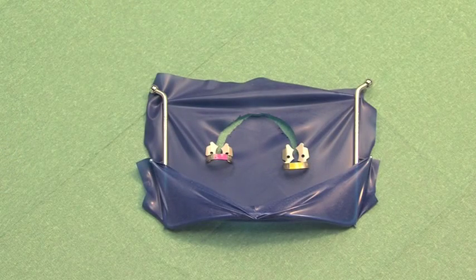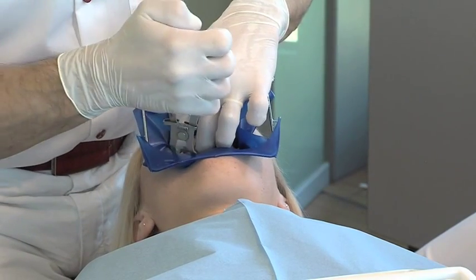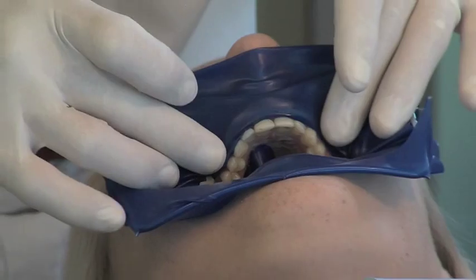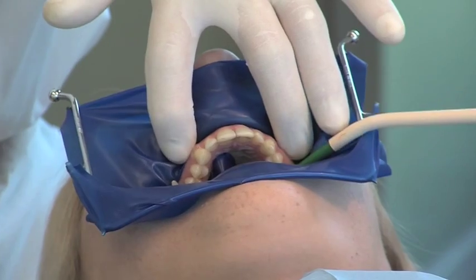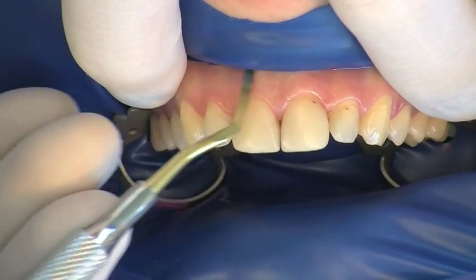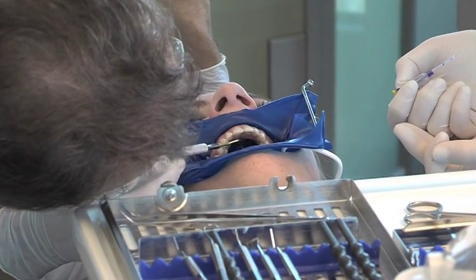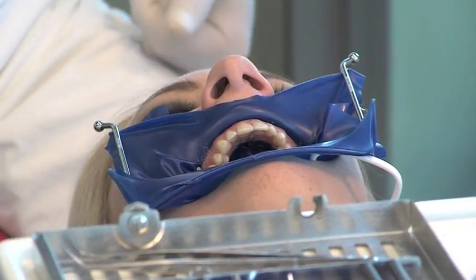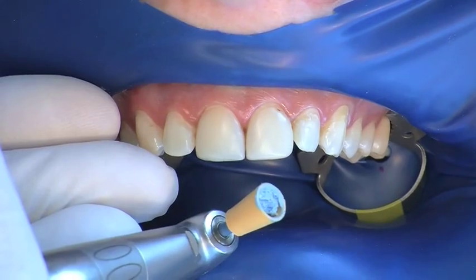The prepared rubber dam is placed over the dental arch and fixated distally by clamps. The facial tab is then attached to the gingiva, and the rubber dam is also fixed on the palatal side. The operating site is dry and clearly visible.